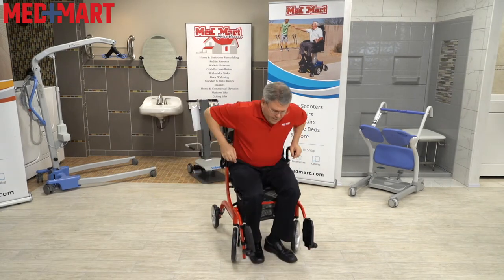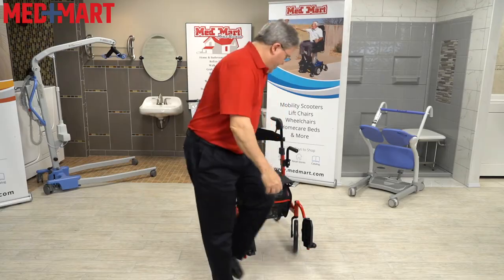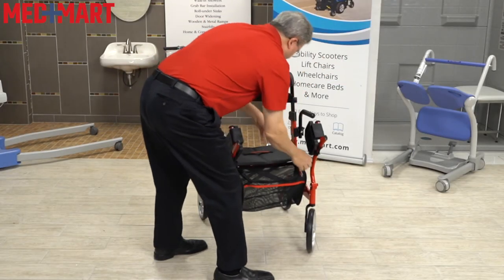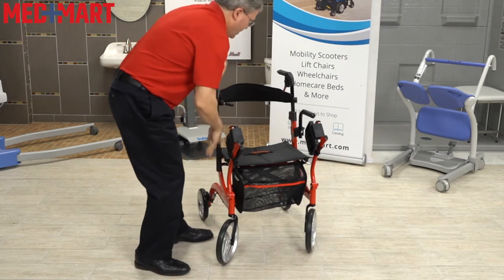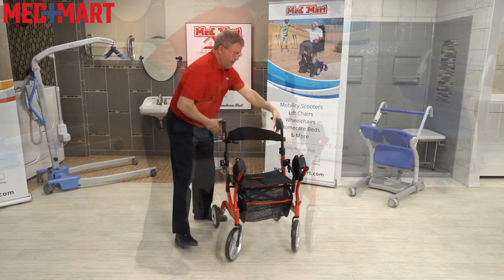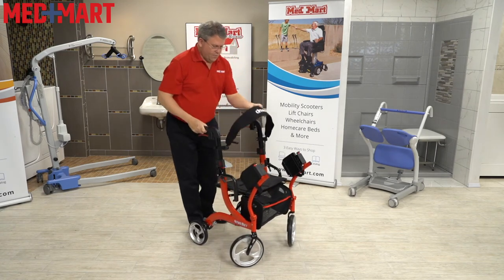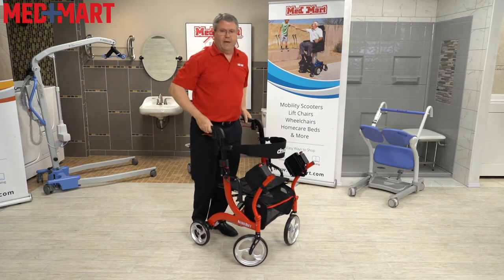It's really easy to reverse the process. Step up, the legs come out. When you don't need the transport chair anymore, these just pull back up into locked position. The armrests come down, and you're good to go using it as a rollator once again, moving the backrest back over.